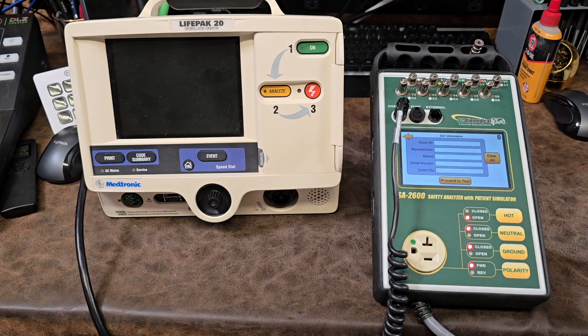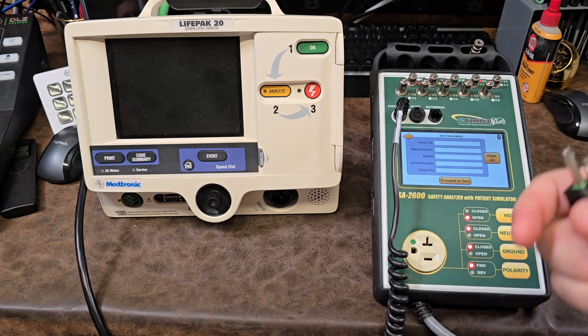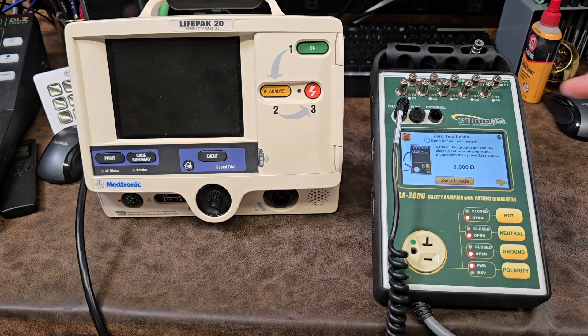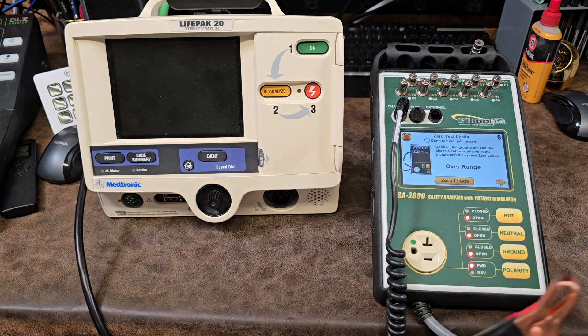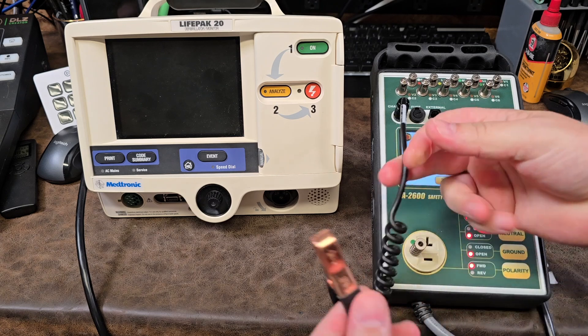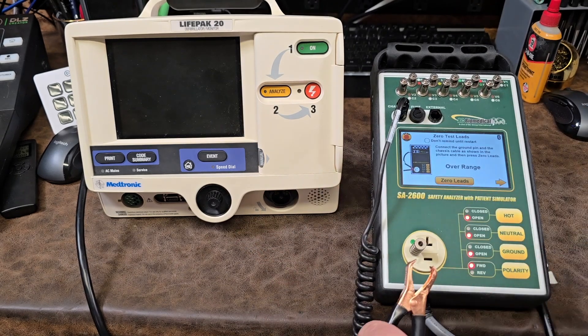It says that we are ready to go ahead and start. We do that by pressing the over arrow. Here's where you can input all the identifying information for the device. Then we proceed to test. The first thing it wants you to do is to zero your leads.